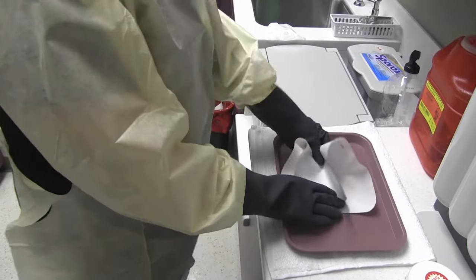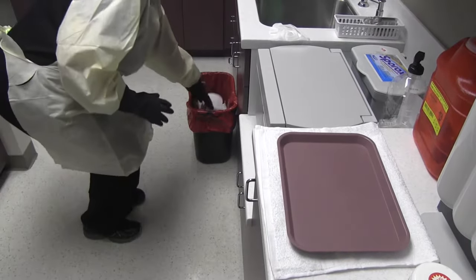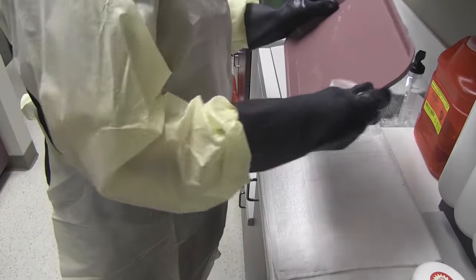While you're waiting, remove the tray liner and dispose of it in the appropriate waste. Thoroughly disinfect the tray.